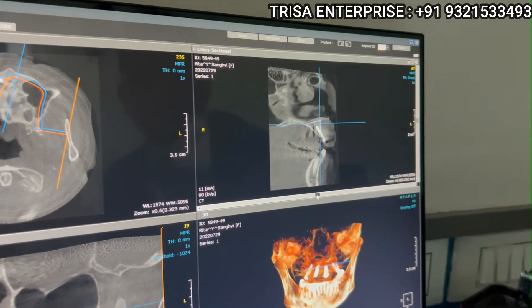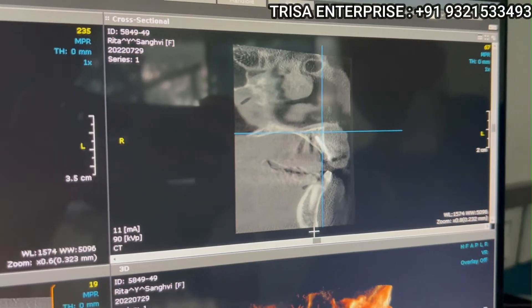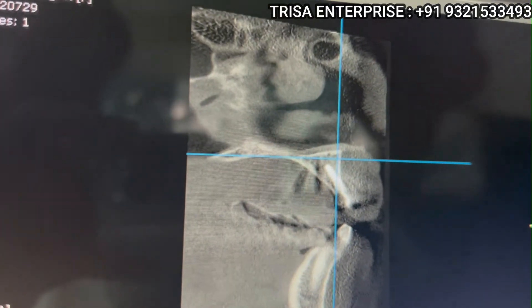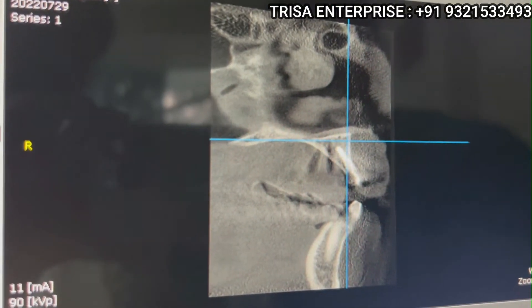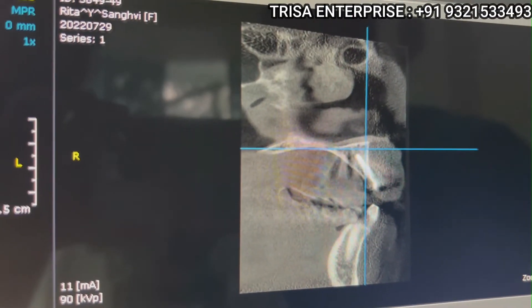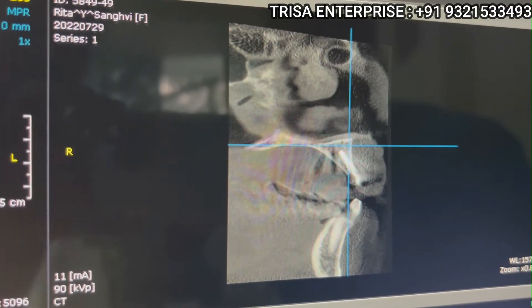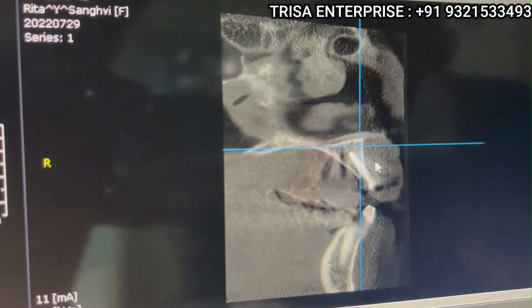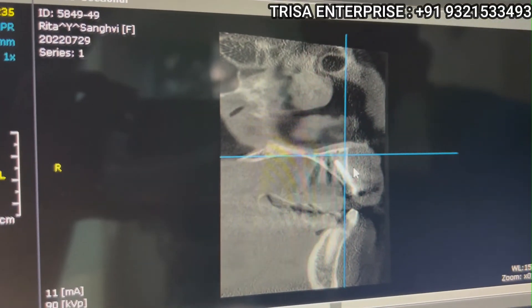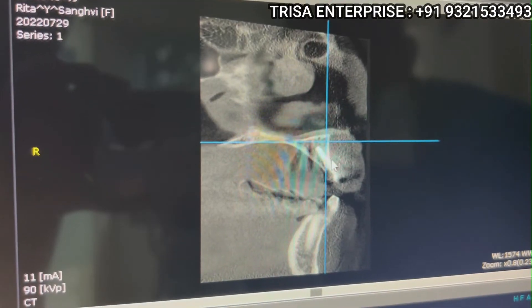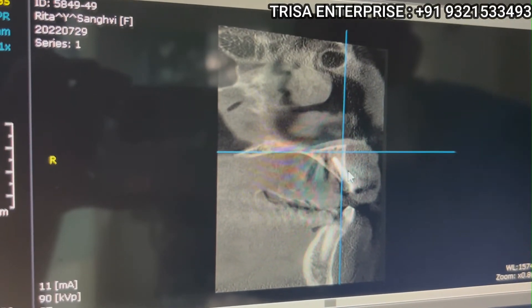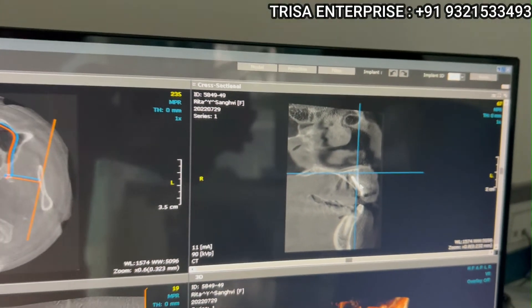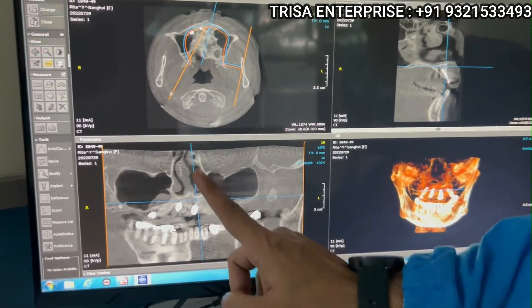Now if you look at this section very closely, you will agree and realize that there appears to be no bone on the labial side. If you are looking at the CBCT printed sections, you will feel there is no labial bone, the threads are exposed. This is one of the common mistakes because these sections are randomly taken.